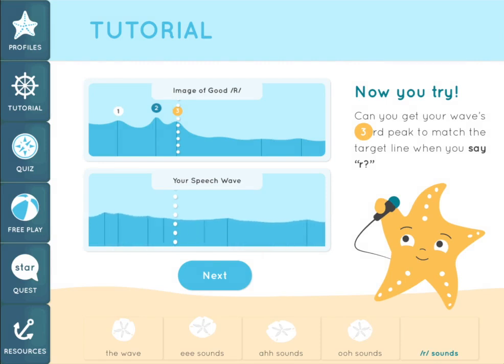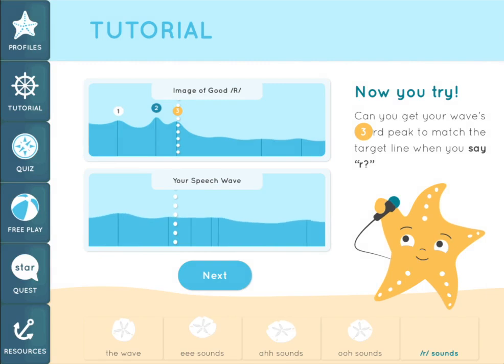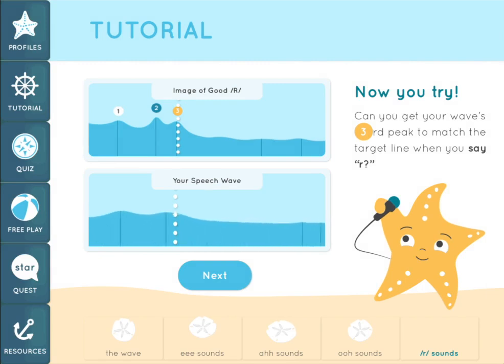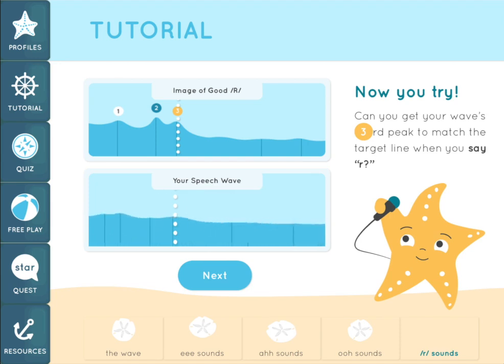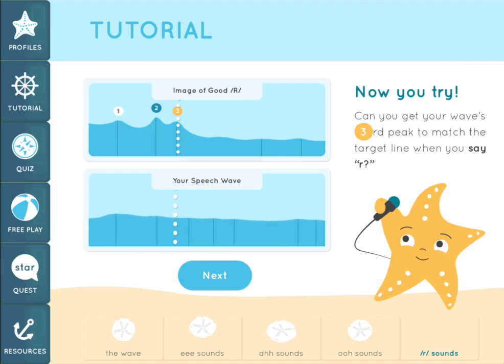I'm going to say a good R sound. Watch for the third peak to come close to the target line. Rrrrrrrr. Note that the second and third peaks merge together some of the time. That's okay because the merged peak was close to the white line.